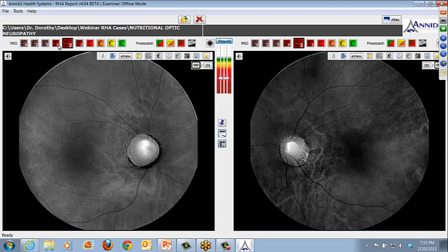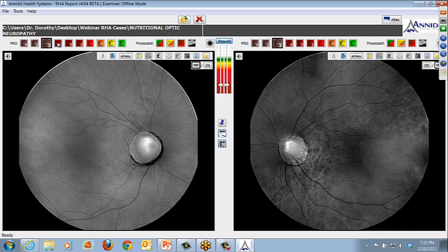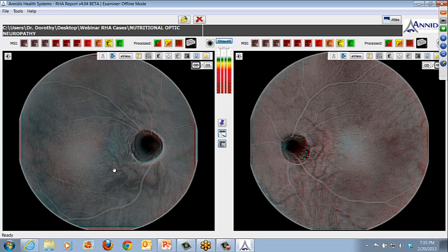I took a look at her retina, and I certainly saw significant peripapillary atrophy, as can be seen here in the reds, and certainly significantly here. There's certainly some asymmetry to the disc, but these are slightly different angled images here. If you look at the stereo map, there's certainly some central atrophy and deepening of the cup here.